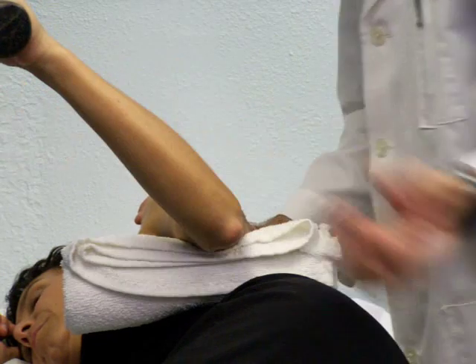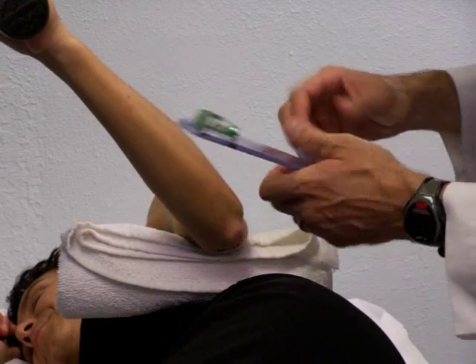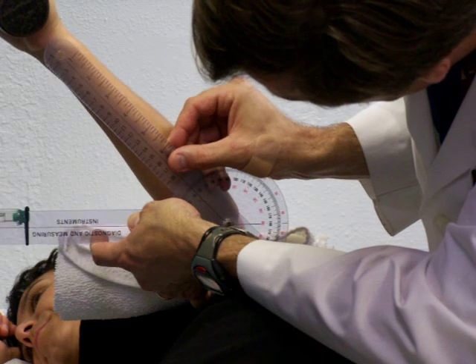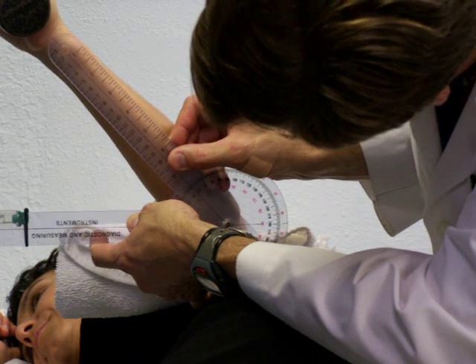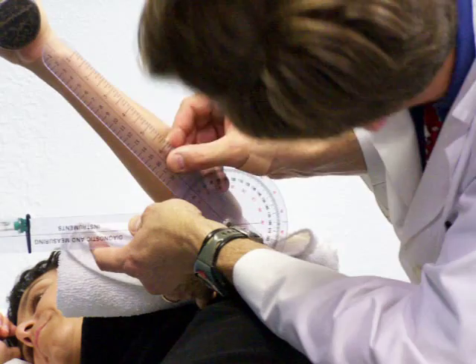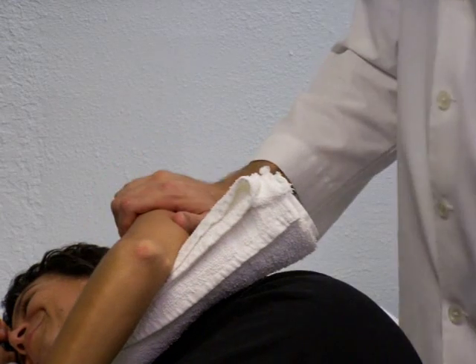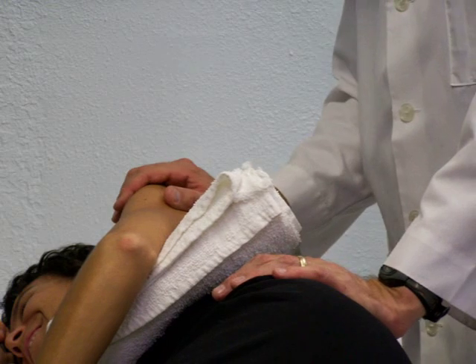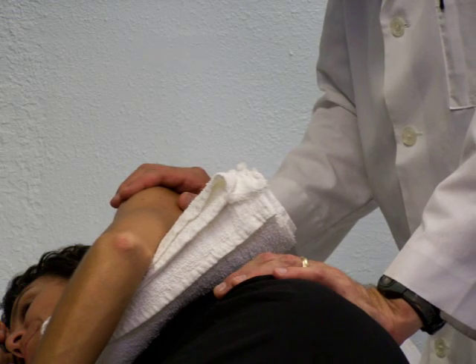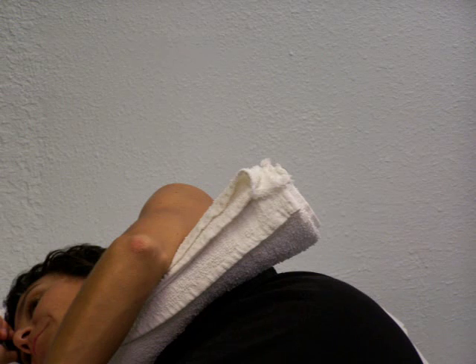Now on this one, I'm not going to help her. That's as good as you can do. Got a hand here making sure she's not substituting or compensating. I'll be as quick as I can because we know sometimes that people who have shoulder pain have weakness in their rotator cuff, and she's got 45 degrees and rapidly getting less. So 45 degrees and 58 was the initial value, so that's a 14-degree difference. That 14 degrees is an objective, quantifiable amount of rotator cuff weakness.